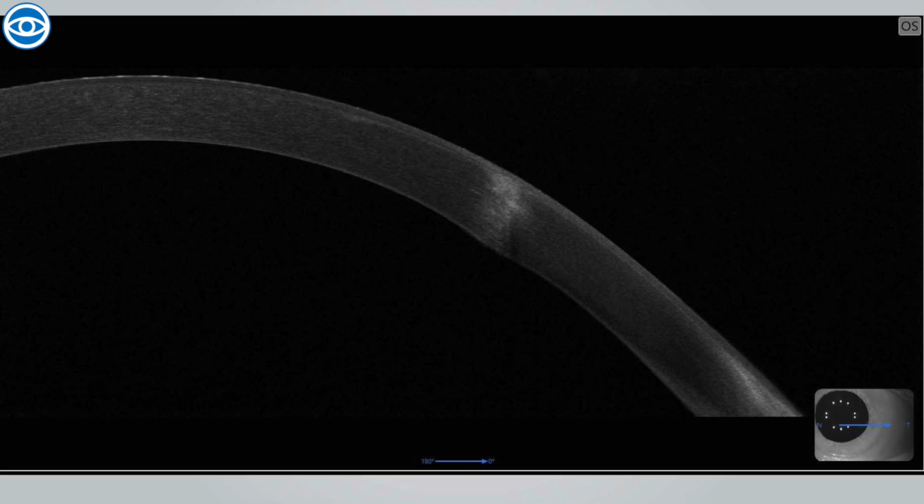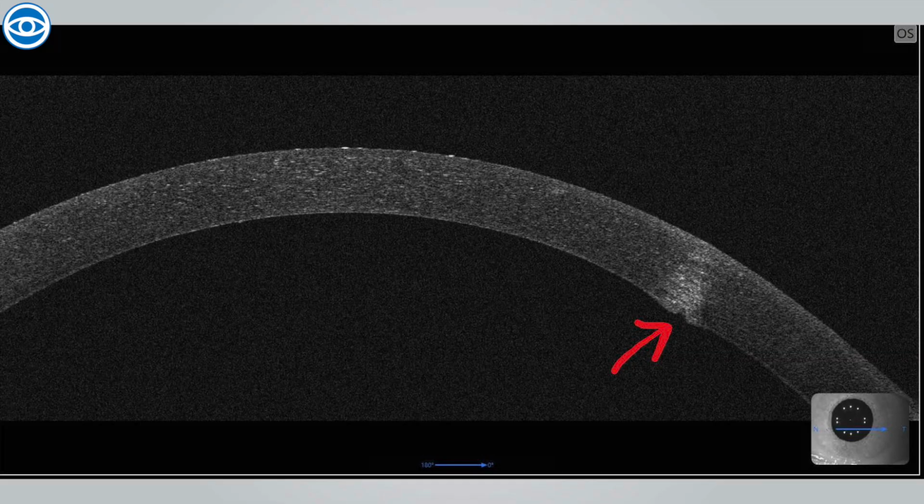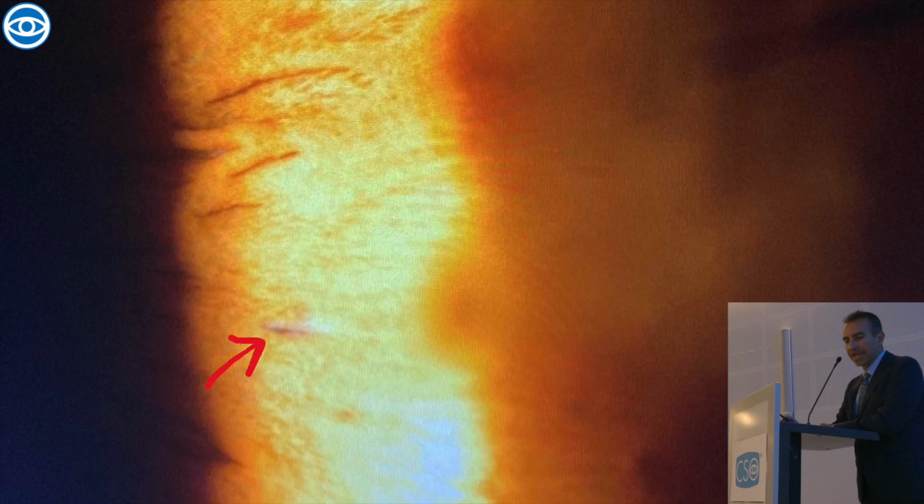So I take a look again on the OCT. That's what I see. It doesn't look like anything is penetrating, but let's take a look again on a raw scan. And scanning it one by one again, you can see that possible point of entry. Kind of something entered and sealed again on itself. I take a look again on the slit lamp, high magnification, and I can see this, just right under that incision there on the cornea. So as if there's a projectile that went in, the cornea sealed back in, and it went through the iris. So I dilate, of course, and that's what I see.